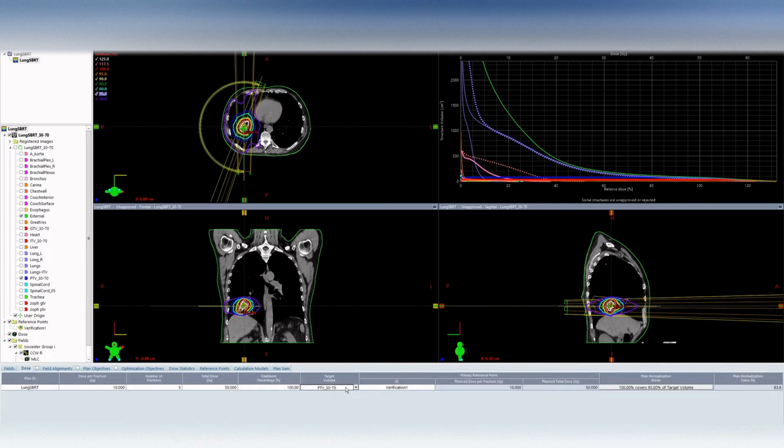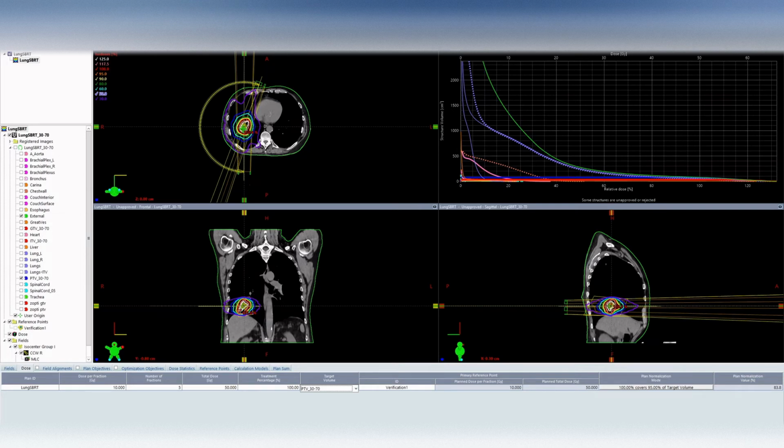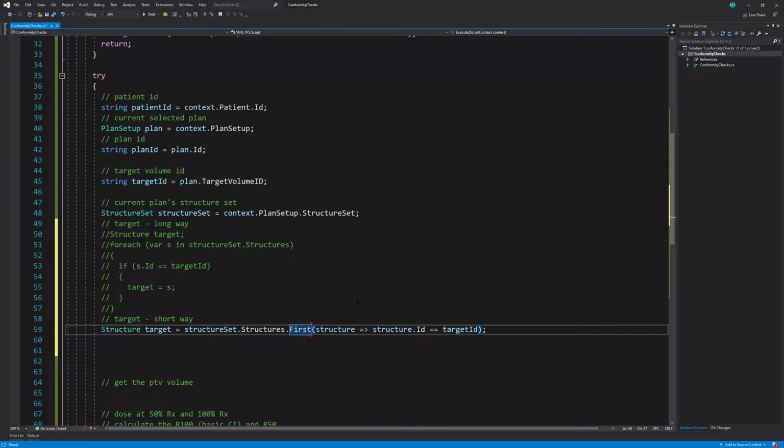So if we go back over here, there's been a target volume that's been selected, so we know that there's an ID. But if we had not selected this, then this would be blank, and there would be no matches. And if you select first and there's no matches, then it crashes. It doesn't have anything to select. So if you do or default, it'll just return null. In other words, the default, and I think you can actually give it a default value.